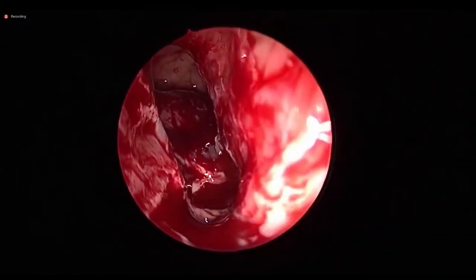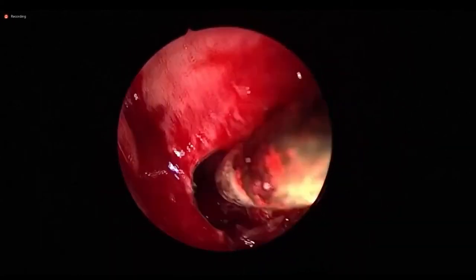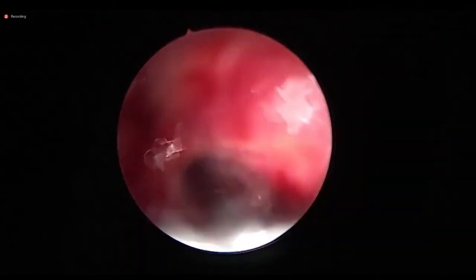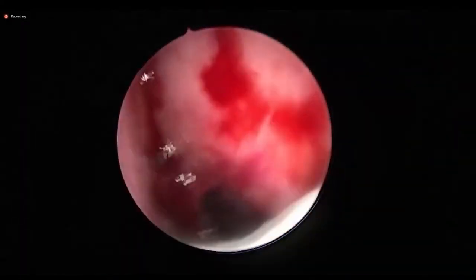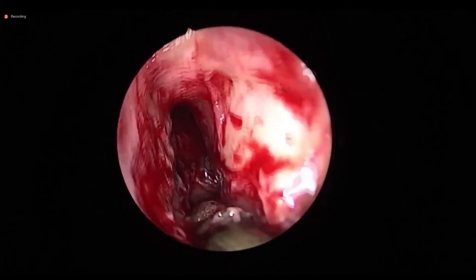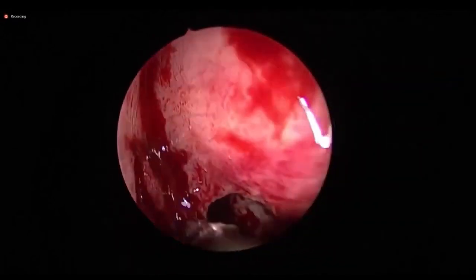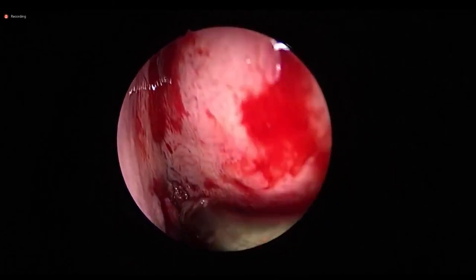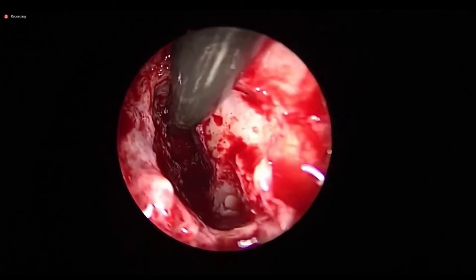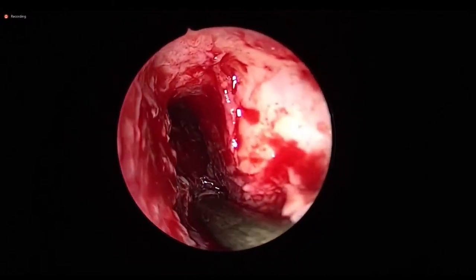See now the frontal sinus crystal clear. This patient had a frontobullar cell. We opened the frontal sinus with the same ease. Went underneath the beak. See the beak now? You should be able to identify this beak. See this beak? See the axilla. Anybody can identify the axilla. Go underneath the axilla, see the beak, follow the beak where it ends in the frontal. See how the beak is ending into frontal. Can you see?